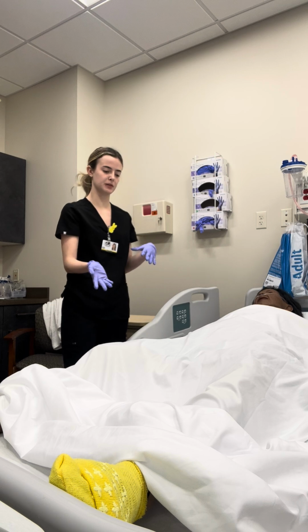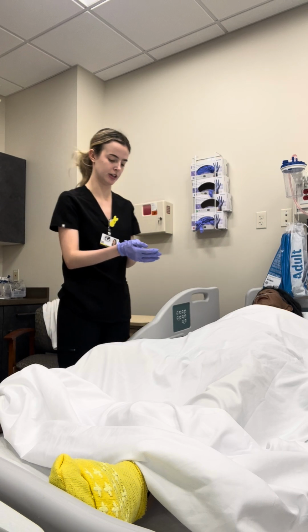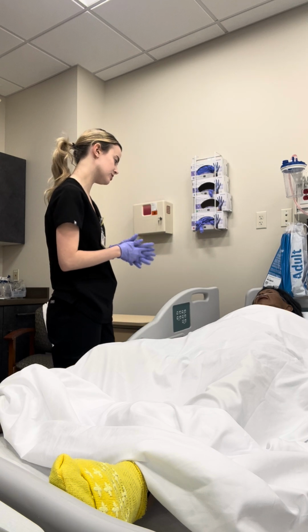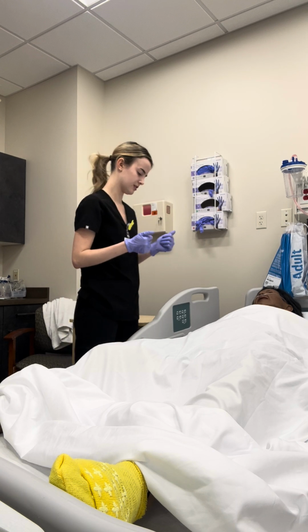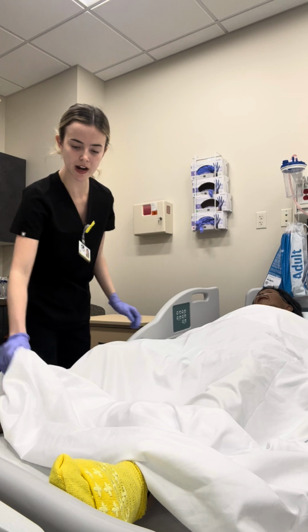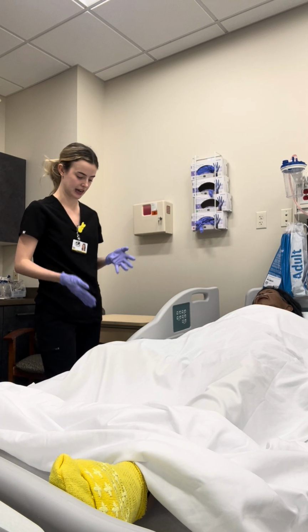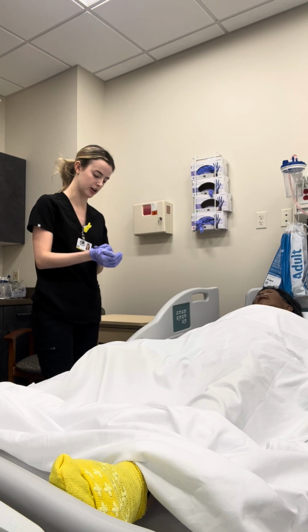And then I would make the patient comfortable. If they wanted to keep laying down, they could keep laying down, or they could sit back up. Are you okay to stay laying down, or do you want to sit back up? Okay, we'll leave you laying down and you can get some rest. If you have any pain, just let me know. And I'll be back in to check that urinary output a little bit.